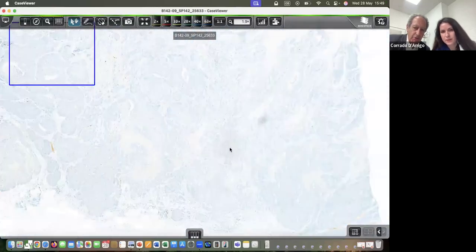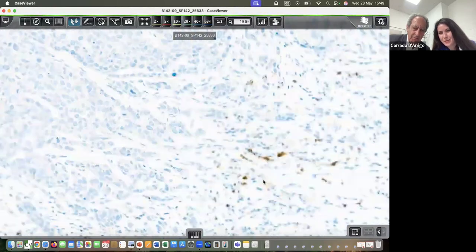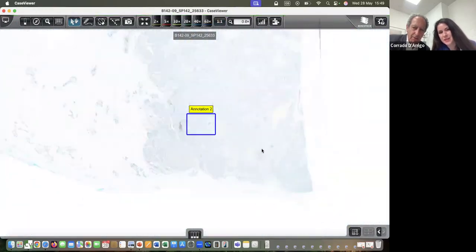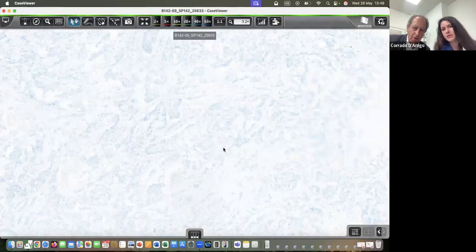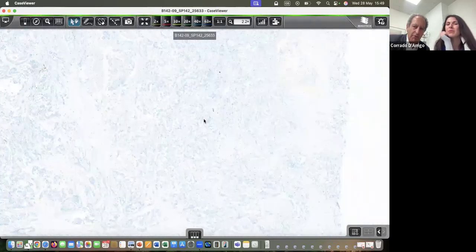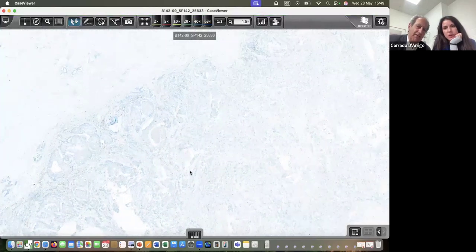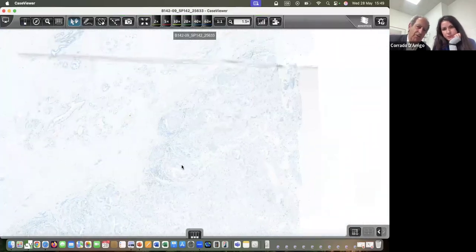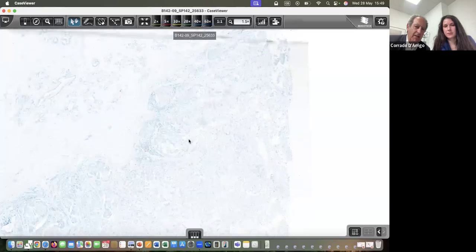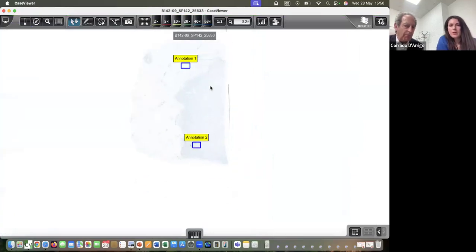I kind of get the impression this is going to be positive at the end of our endeavor. I have the same impression. Because even only from this lower fifth, I would say, of the tumor, we may fill up all of it. So this would be a case where I work on it, I make up my mind, and then I call my colleague and say, well, what do you think of it? This is what I think. Probably will say positive.